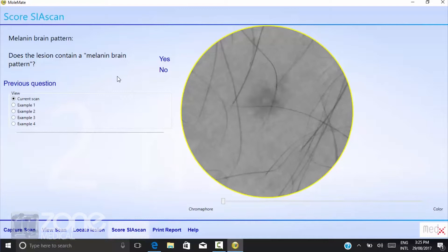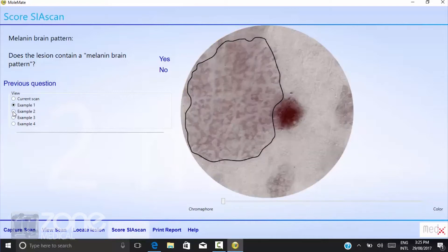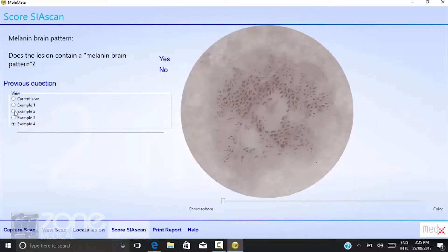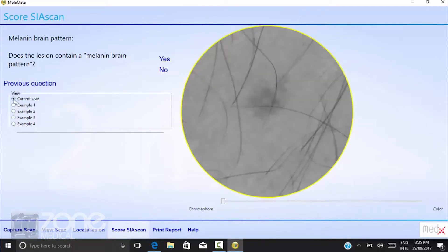The next question asks for a melanin brain pattern, and it will give you an example of what that looks like on the examples shown below your scan. Once again, there is no melanin brain pattern in this particular scan, so the answer is no.